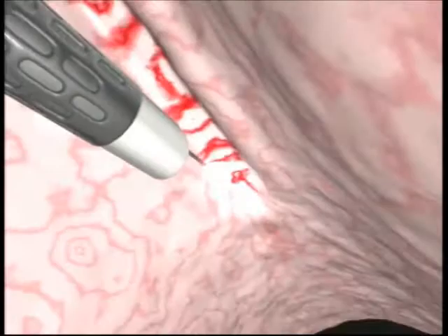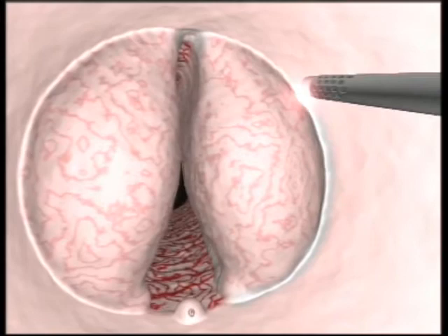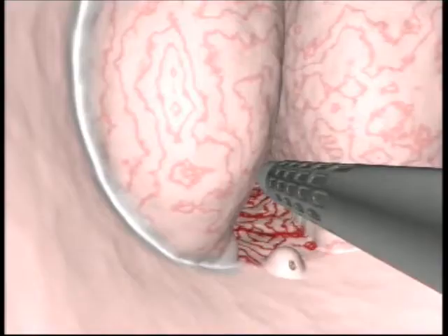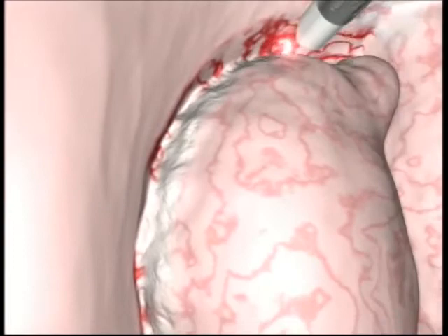A retrograde incision is performed from the bladder neck, from 5 o'clock to the marker at 12 o'clock, thus delimiting the lateral lobes. We then proceed with a 180-degree rotation of the resectorscope, which is used to lift and push the lobe medially in order to expose the plane of dissection.